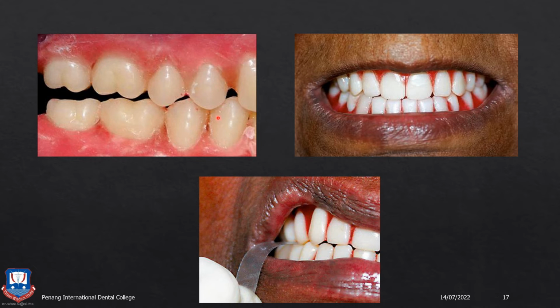But when you see the centric occlusion, you see that there is a posterior open bite. The teeth are not in contact. This could be due to an error in the secondary impression. This could also be due to an error, most likely during the jaw relationship step. That is, maybe the heels of the denture were touching prematurely before the wax rims came in contact, or the patient did not give a proper centric relationship, or the record bases were faulty and distorted. This could result in something like this.